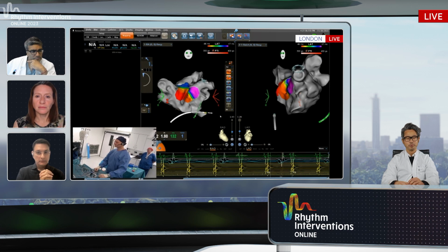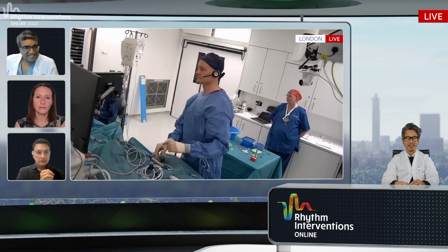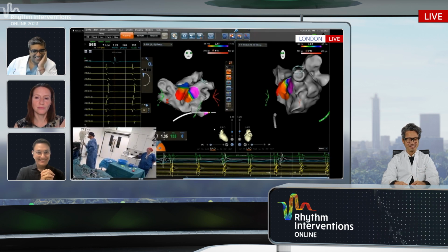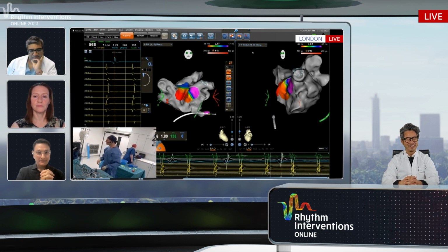Yeah, and just maybe one brief comment from Vivek. I know Vivek would never have two gaps in one vein or one circle after cryo, so therefore PV reentrant tachycardia would not be an option for Vivek. But apart from this, Vivek, your thoughts?